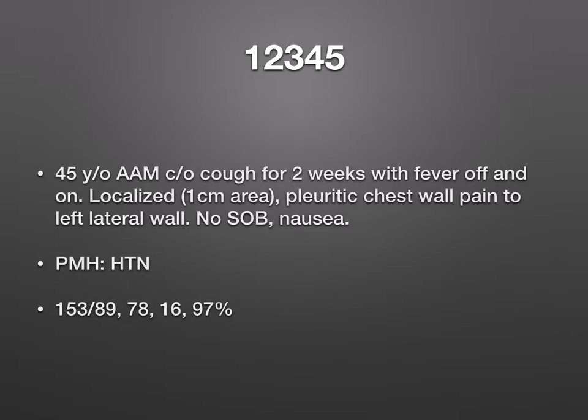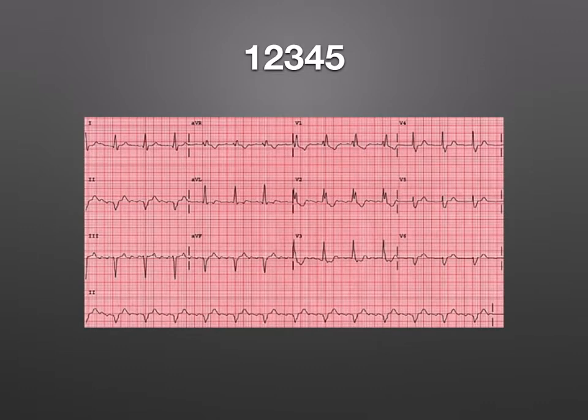So here he has chest pain. This is not the most convincing chest pain in the world. As a matter of fact, I think we would all look at this and say perhaps there's an alternative diagnosis. So if we're going to call this a STEMI, we'd better have an incredibly impressive EKG, right? Well, here's our EKG. Now, I'm not terribly impressed with this ECG. What I see is a sinus rhythm with a right bundle branch block, but I don't see any elevation.